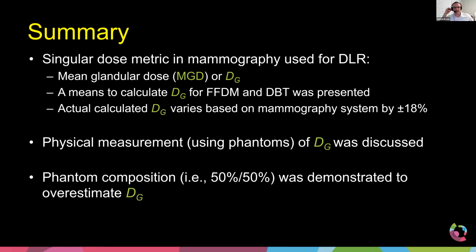So yeah, there's kind of two answers I would give to that. The simple answer is, if you have the DRL, you do your best to try to get your value closer to that DRL. But you have to look at your image quality. So that's the simple answer.